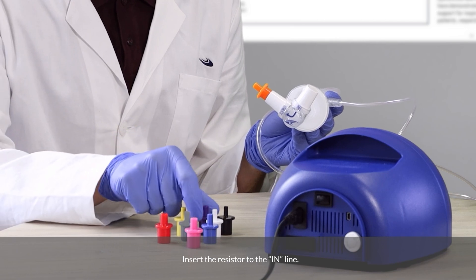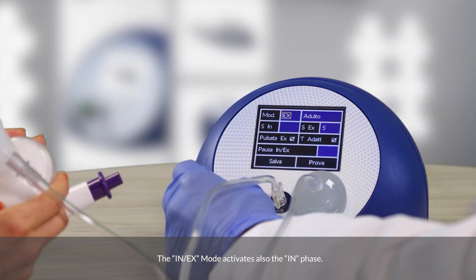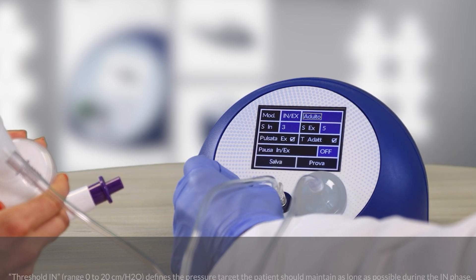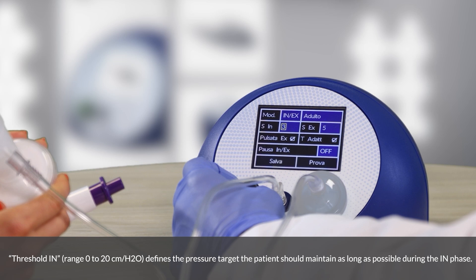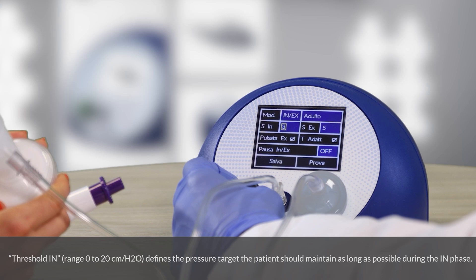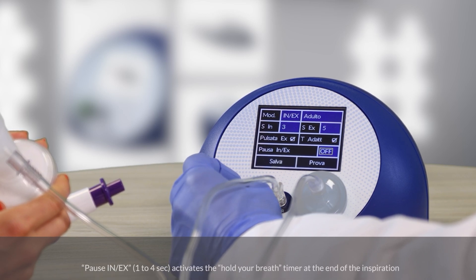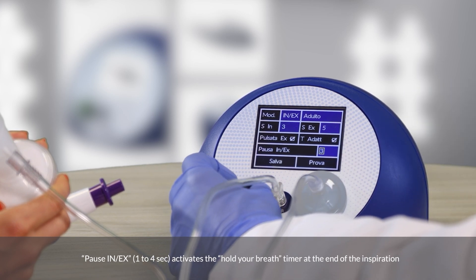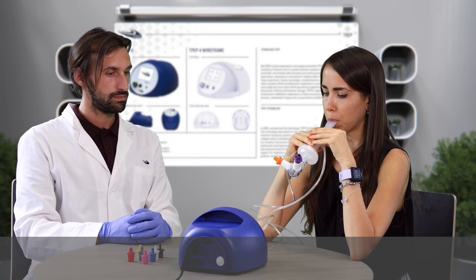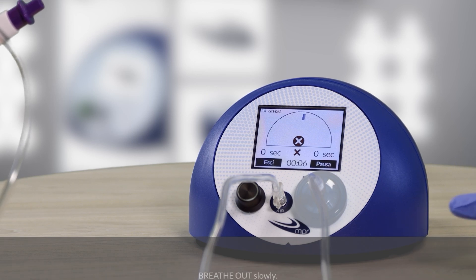Insert the resistor to the IN line. The Inspiratory-Expiratory mode also activates the inspiratory phase. Threshold-IN range: 0–20 cm of water — defines the pressure target the patient should maintain during the inspiratory phase. Pause-IN-EX 1–4 seconds activates the Hold-Your-Breath timer at the end of inspiration. Breathe in slowly. Hold your breath. Breathe out slowly.